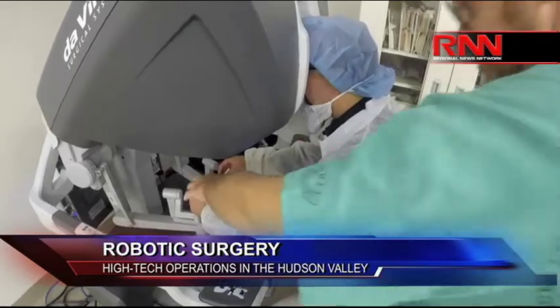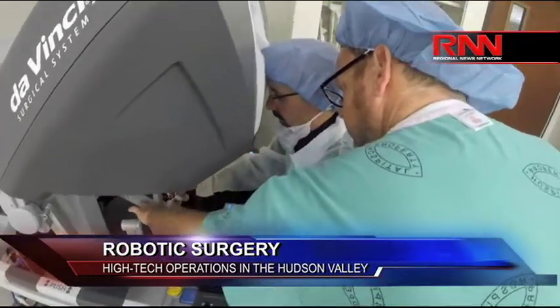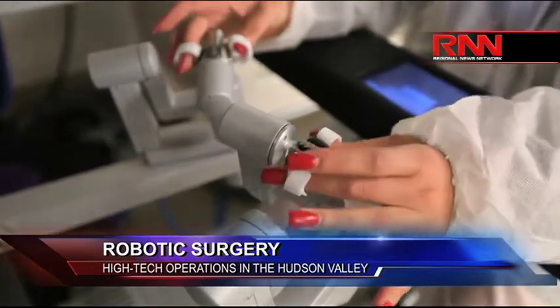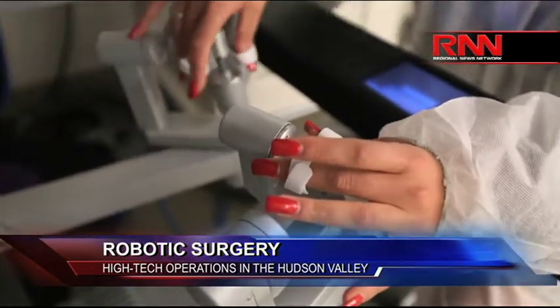So they're making these tiny, millimeter-measurement incisions, as opposed to cutting somebody from stem to sternum, as they used to say. When you're having a huge open wound, there are so many more complications that come into it. So that's when you start talking about a highly complex surgery that previously you couldn't do without the robot, and now you can. That's saving lives, really, when it gets down to the bottom line.